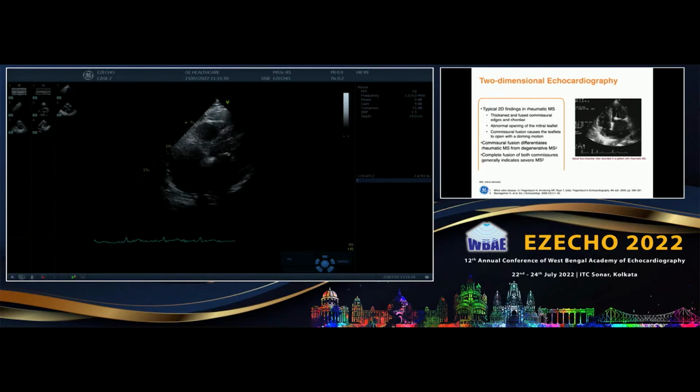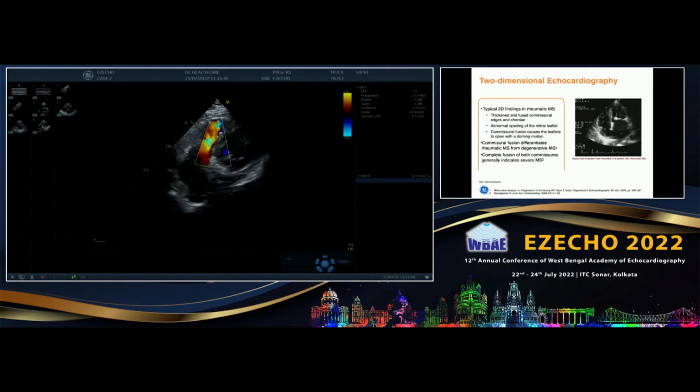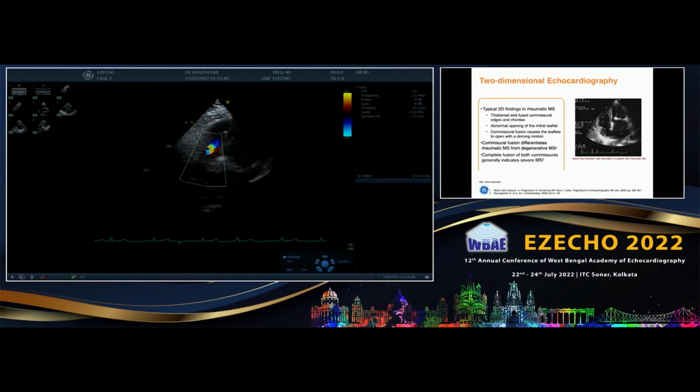We have this wishful thinking that once we have reduced the transmitral gradient by, say, putting a balloon there, the TR will reduce and everything will be fine. It's not that. Okay, so we saw that there is a TR. We expected it. We expected at least a moderate TR there, and we knew it.